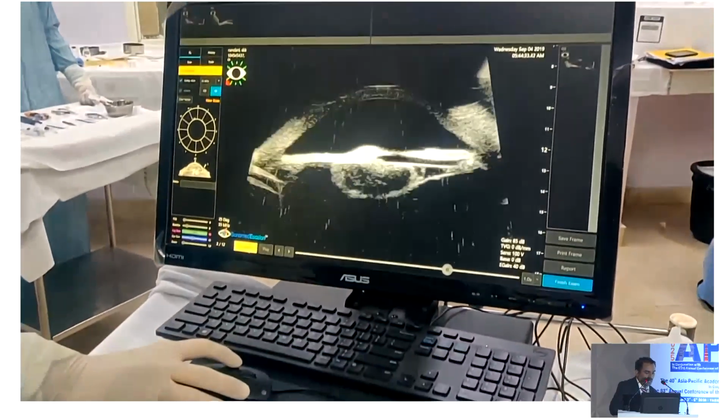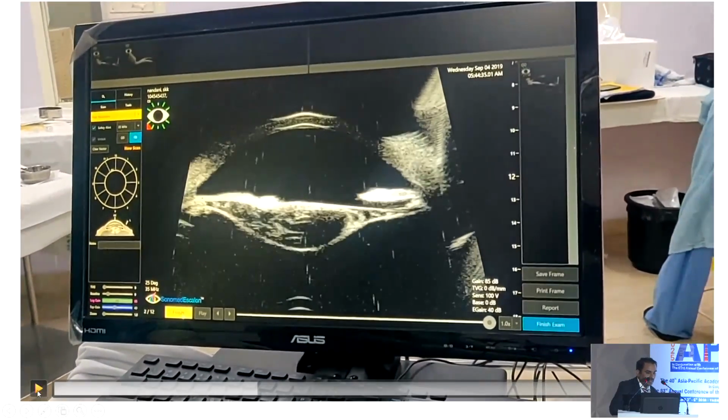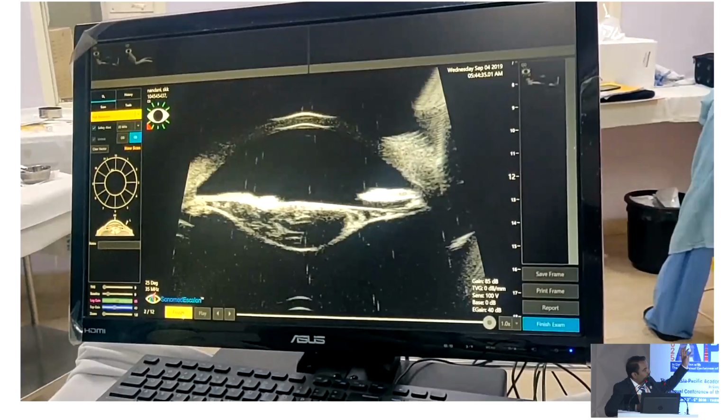Once you do that, you can see the lens details here. The more you move into the water, the scan will move up. So that's how it tells you not to touch the probe, and if you move more upwards, the scan moves down. So it should be in between so that it exactly fits, so that it gives the details from the epithelial surface till the anterior vitreous, because we want to see the PCD changes also in some cases.